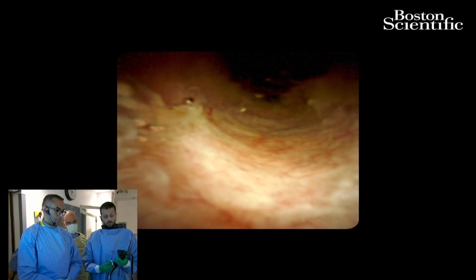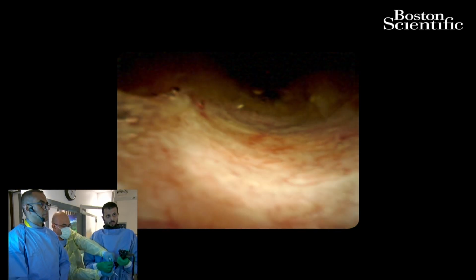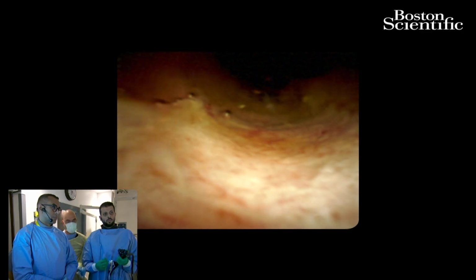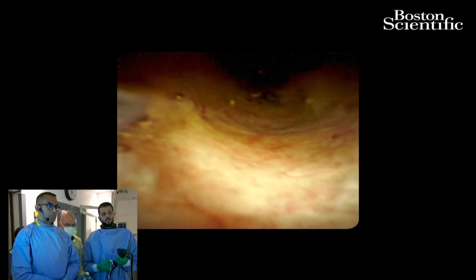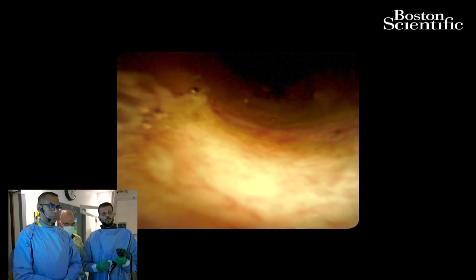So who placed the plastic stent? They should have done the spyglass from the start, and so I agree with what Ahmad and his colleagues did, that this case especially needs a good assessment from the beginning to determine whether it's benign or malignant. And there's another point, which is when to do the spyglass. Do you do it in the index procedure or not?